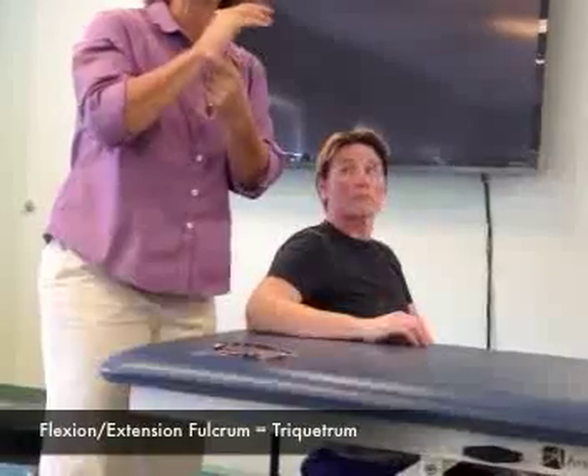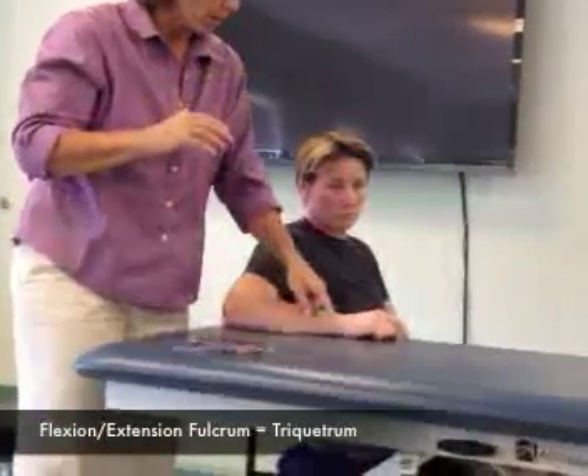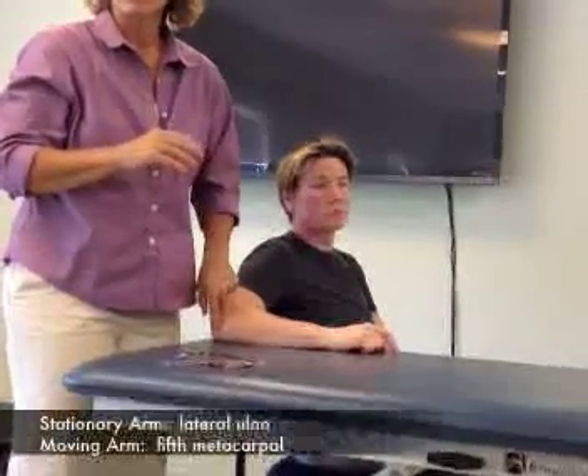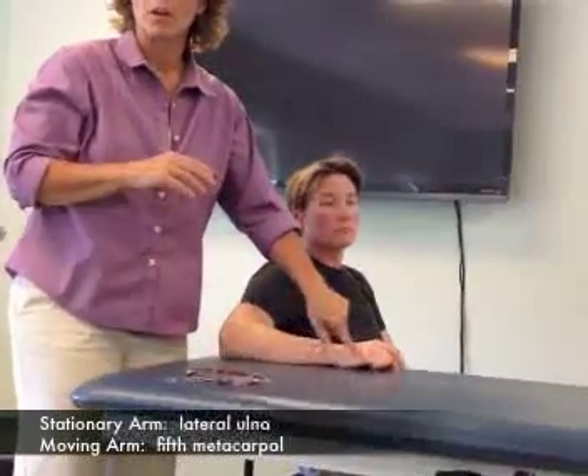My fulcrum is going to be right off the triquetrum — that's where my fulcrum is. My stationary arm is lined up with the lateral ulna to the olecranon, and my moving arm is going to be the fifth metacarpal.